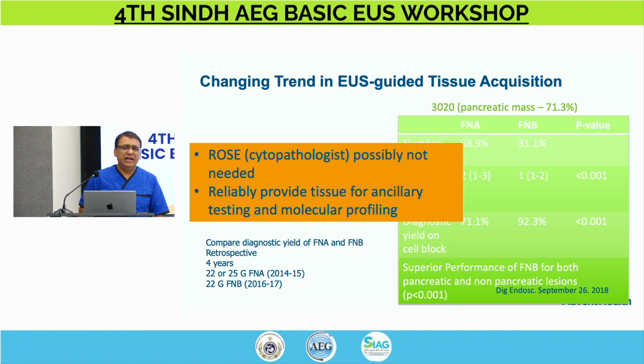I think really for me it does make a difference. And if you feel like complete suction is not making any difference for you, whatever works, honestly. That's what I say. There's no consensus. If somebody tells you this is the best technique, what they really mean is that it works for them.